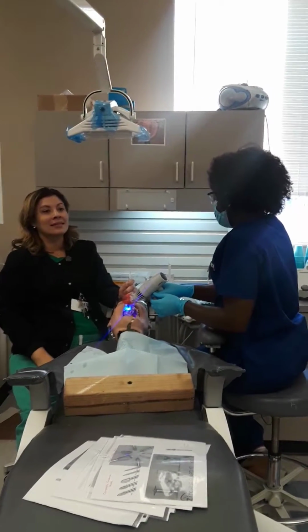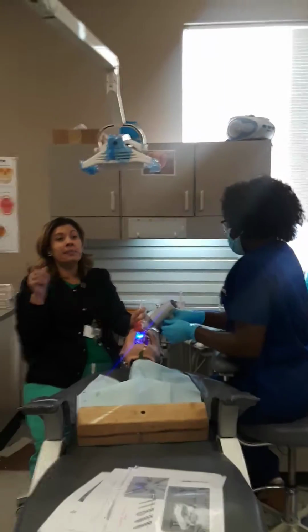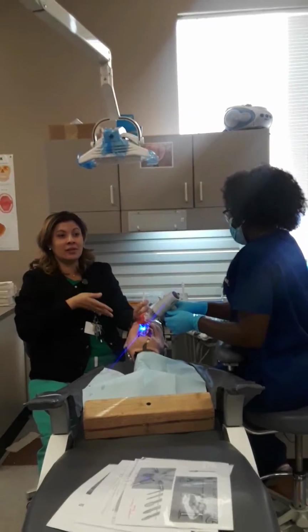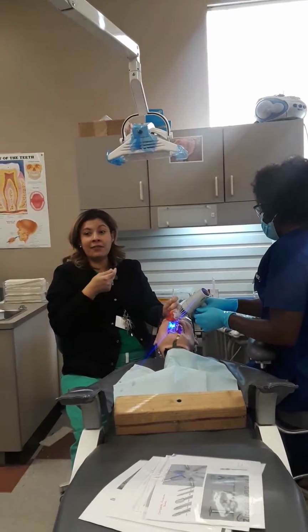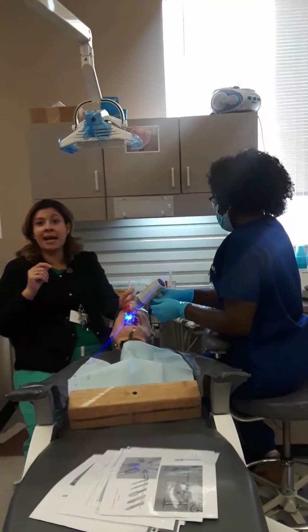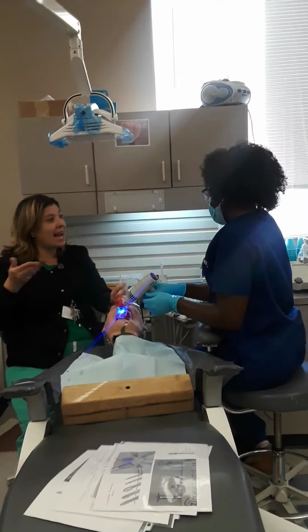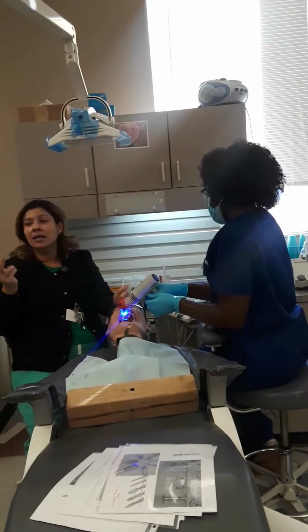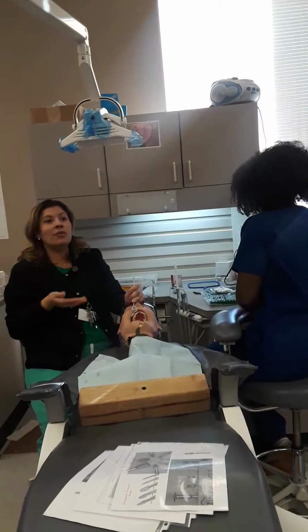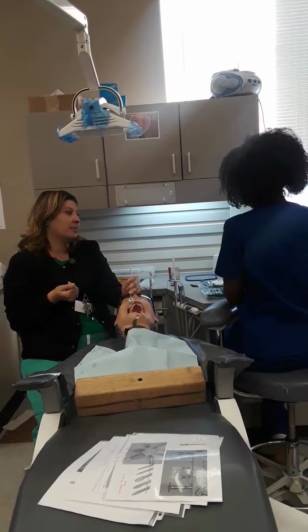So, if we do use a matrix and wedge, will we place it before the etch or no? Yes, so put that note there as well. Good question. We don't have any mesial or distal surfaces, we're working on facial. But if we are working on mesial and distal, that's prior to etch. So your matrix band is always before etch, not after. I'll tell you why. If you put a matrix band after, you're going to draw blood, saliva, things like that, and then you're going to have to re-etch. So then that's acid again, and we're opening the tooth longer than we should, so it'll make the tooth sensitive. Gotcha.